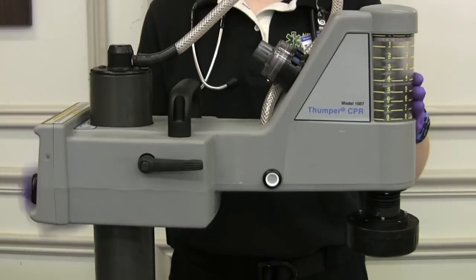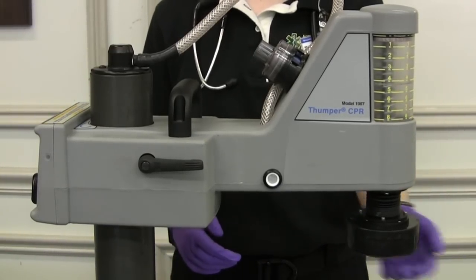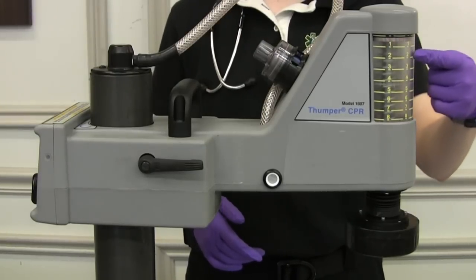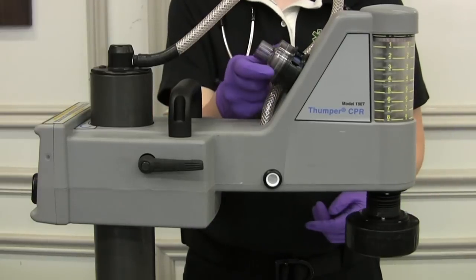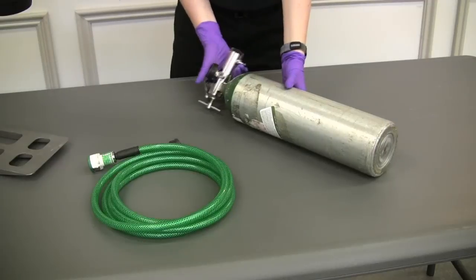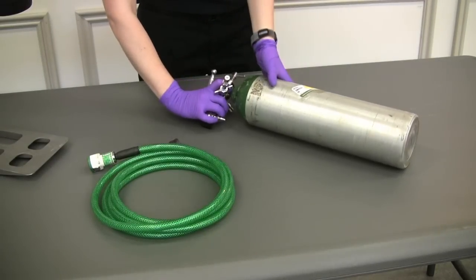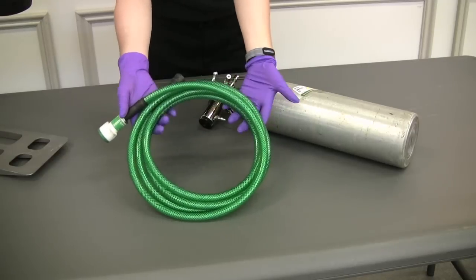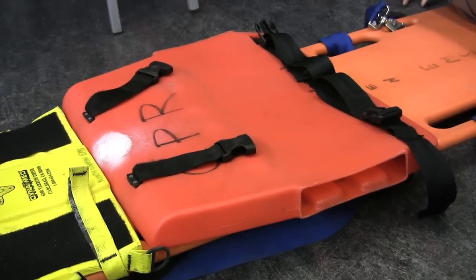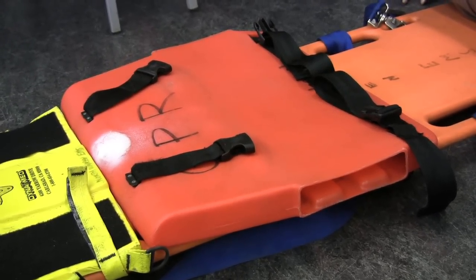This is the arm and column assembly. We have our massager pad, the dome which holds excess air and lets us know the depth of the compressions, and our ventilator connection. Here we have our oxygen tank with the appropriate adapter and our oxygen tubing that comes with the thumper. Here is the thumper backboard which attaches to our main backboard and allows the thumper to slide into place.